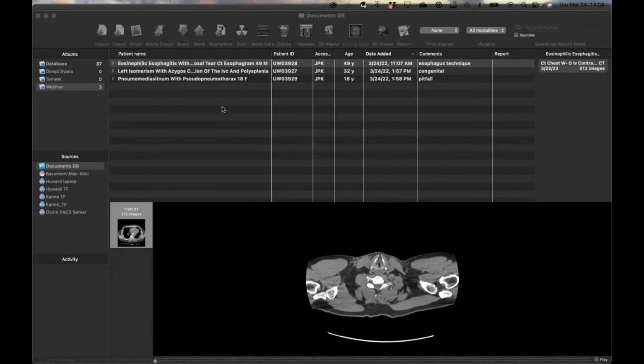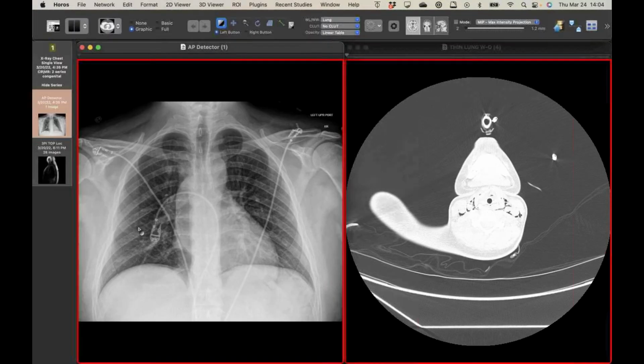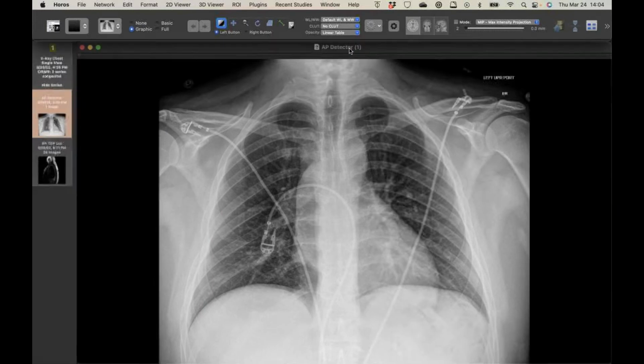All right, so I have a couple cool cases. This is a fun one. I saw this portable radiograph, and I can't remember why the patient came in, like chest pain or something. I had no comparisons at the time, but this caught my eye, the azygos here, and I wondered if he's got something congenital going on, because that's a really big azygos. Otherwise, looks normal. I was trying to look at his airways though, and I wondered if this bronchus is under the pulmonary artery.